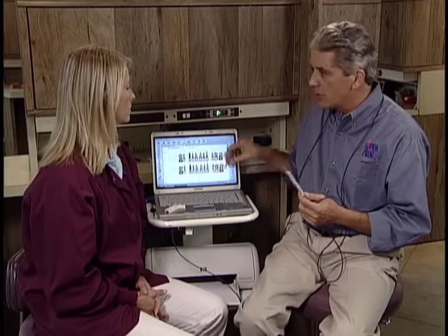Third one is simply misstepping on the foot pedal. And in a few minutes, we're going to work on the ergonomics of the foot pedal to minimize those mistakes and minimize fatigue over the course of using it for the day. The fourth one is really not a mistake, but I use it most applicably for delayed bleeding.